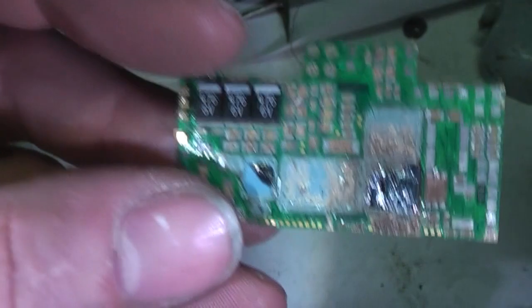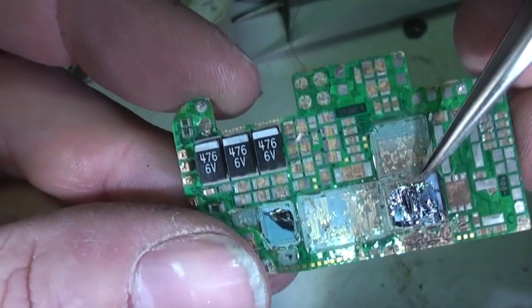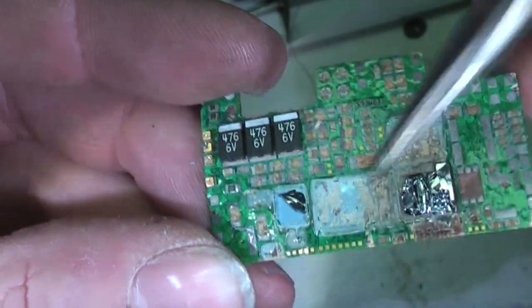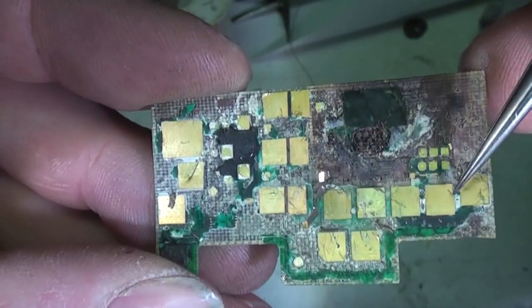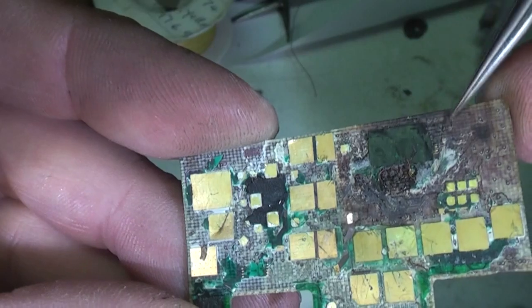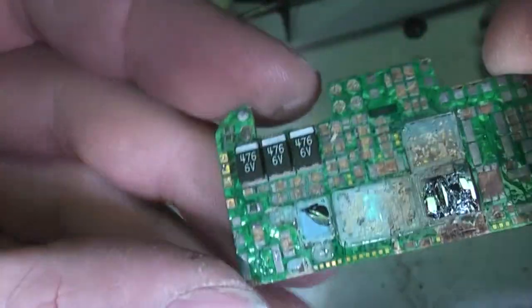Right, so here's what's left of the PCB after my various attempts to strip it off using a mixture of chemicals and heat. There's still one chip left there. It's too broken up to be worth trying to take off to look at. So on this side you've got these three pretty big chips. Slightly smaller one here. Most of the discretes are on this side. On this side, these small devices here are discrete semiconductors, and some of these are the MOSFET type devices. And there's one very large chip here, which I think was that memory device. There's a couple of medium-sized ones here, but pretty much every bit of silicon on this looks like it's custom.